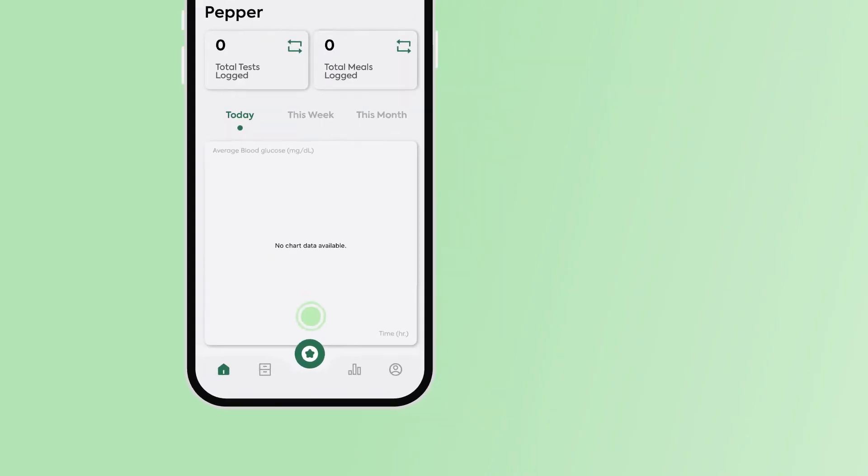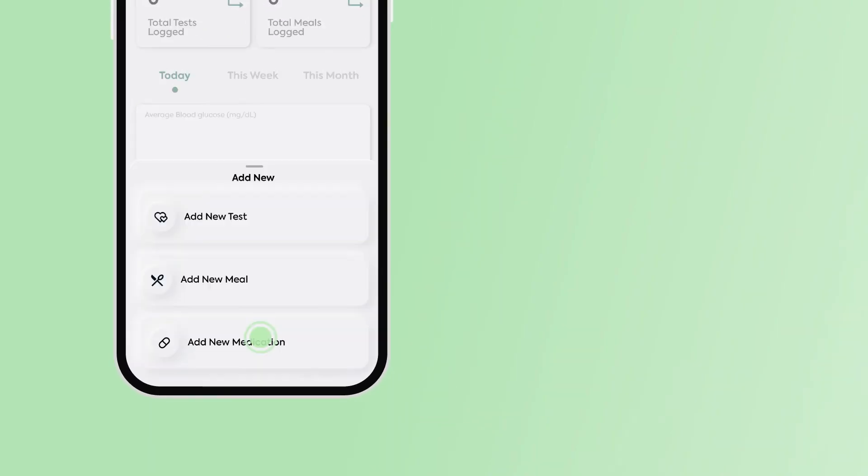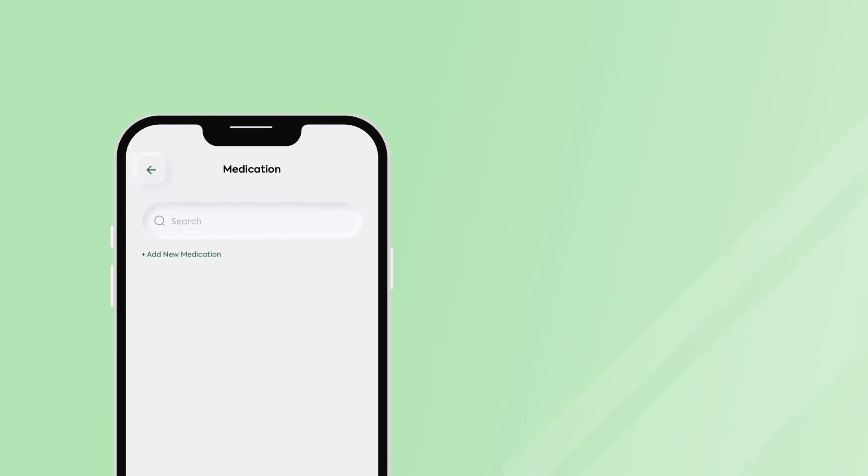Add new medication. Click on the Okra Pro logo button and click on the add new medication option. Choose add new medication and enter insulin.